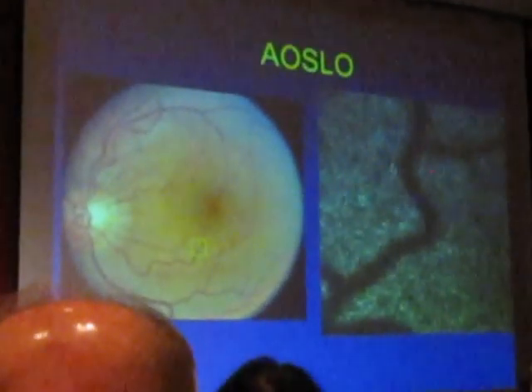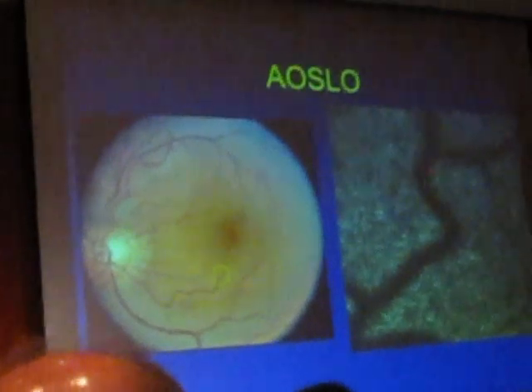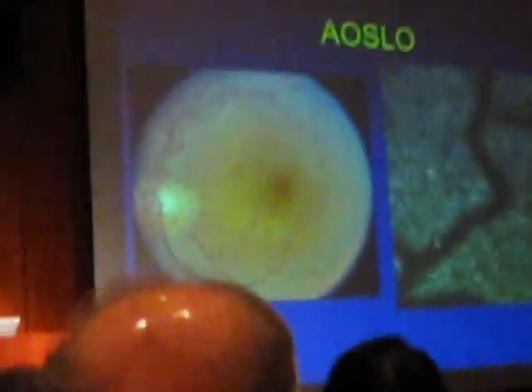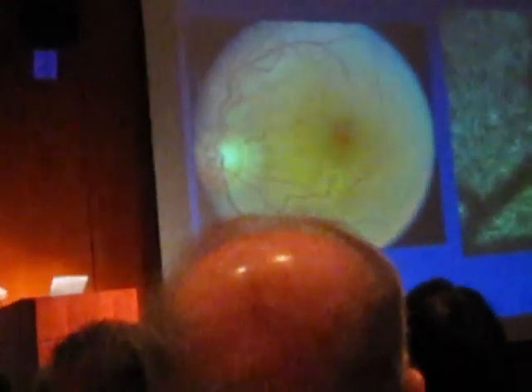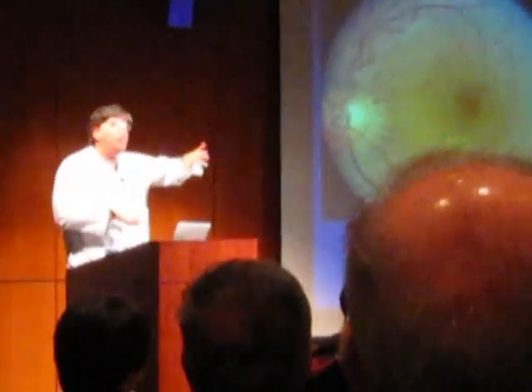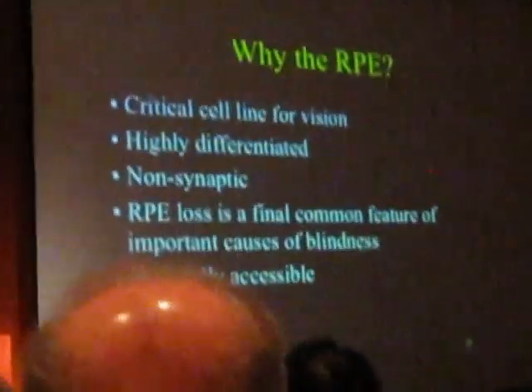Now, I am hoping that I can start this video. Maybe that, please. This is such a great video, it's worth trying. This is an AOSLO video. Oh well, sorry. This is this area here, you can see this vessel, and basically what the scanning laser ophthalmoscope with adaptive optics does is focus up and down through all the layers of the retina. And you'll have to see it next time, I apologize.